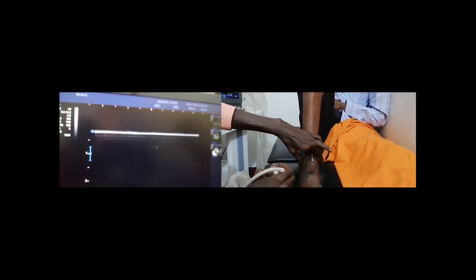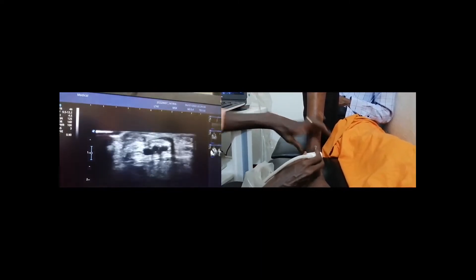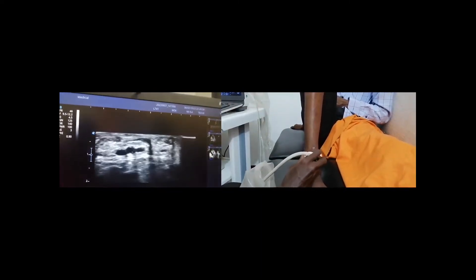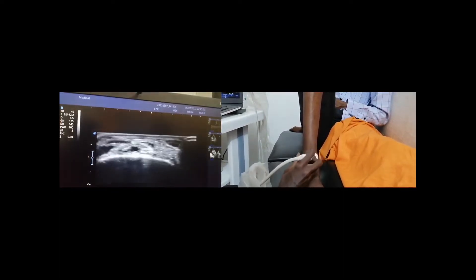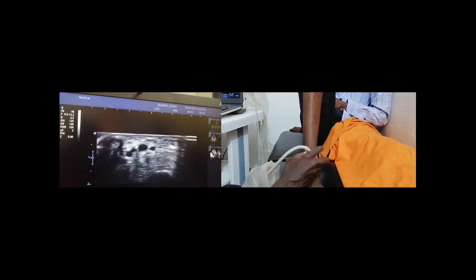Our landmark here, between the two malleoli, we are going to put the probe transverse so we can identify the tendons.